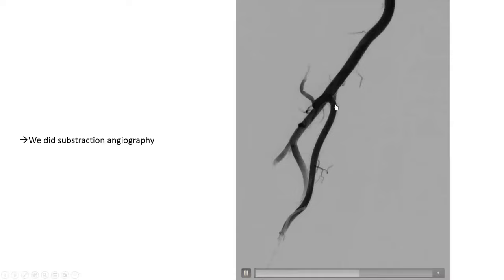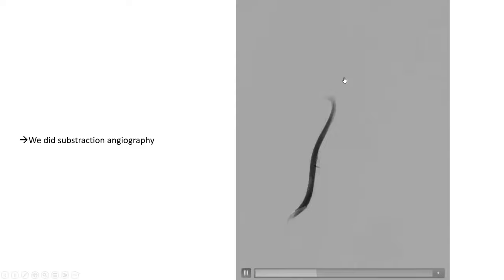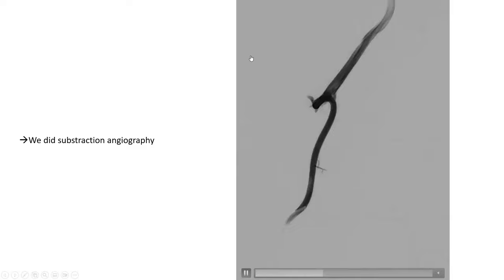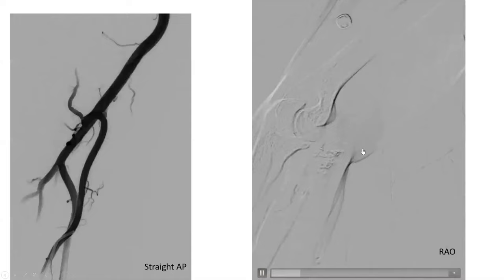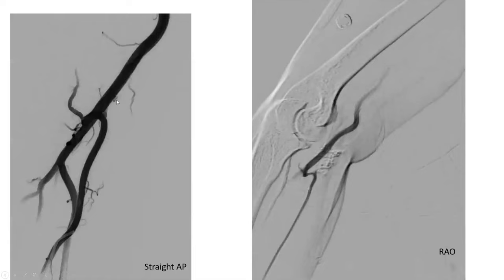This was done in an AP view, and there is actually a loop here. The loop is in line with the brachial ulnar artery, so this view is deceiving. You have to look from the side. You have to do an ipsilateral angled view to really open up that loop. And this is what we did here. We did RAO, and we opened up that loop. That loop was here, superimposed on the brachial ulnar. We opened it up here.